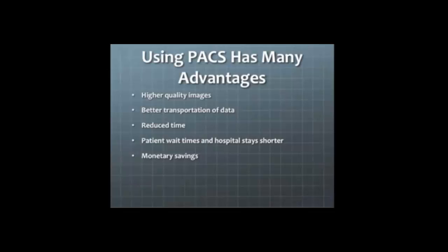Savings on purchasing films, the chemical to process the films, the film jackets and packets, and salary of the staff that would be needed to process the film. Also on the film-based equipment, the film storage space, handling costs, and transcription costs.